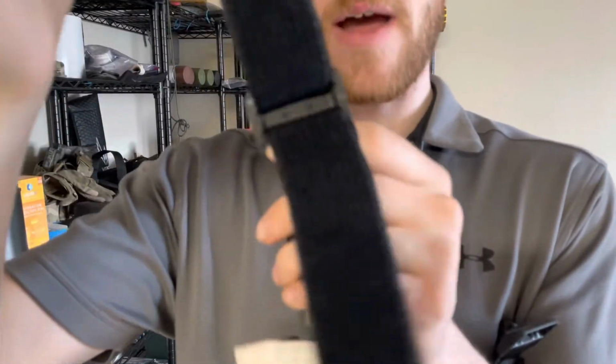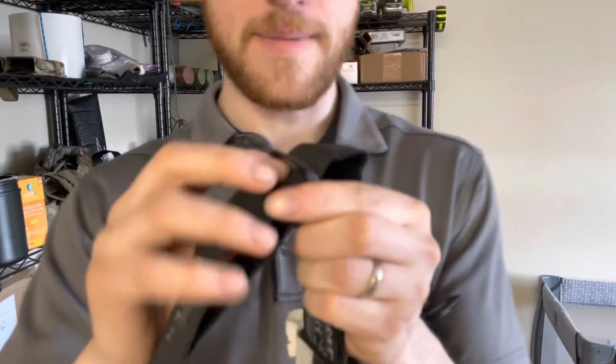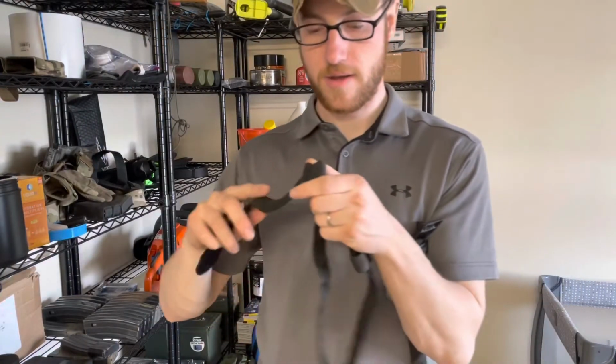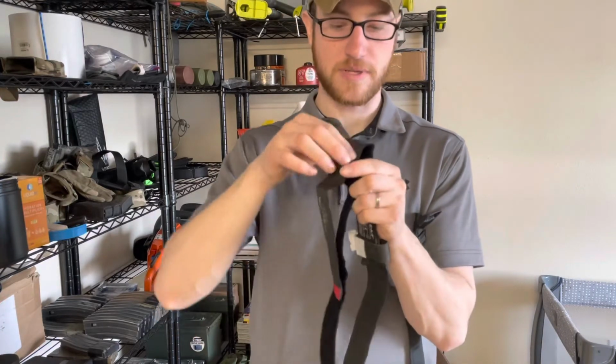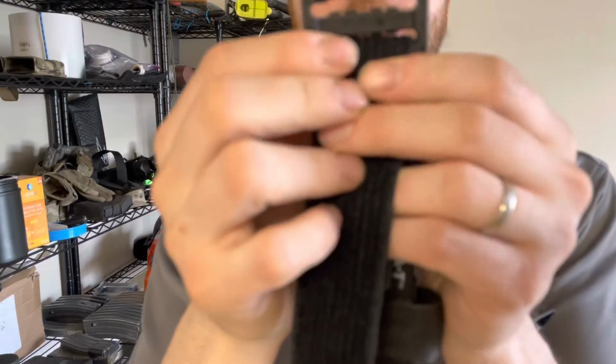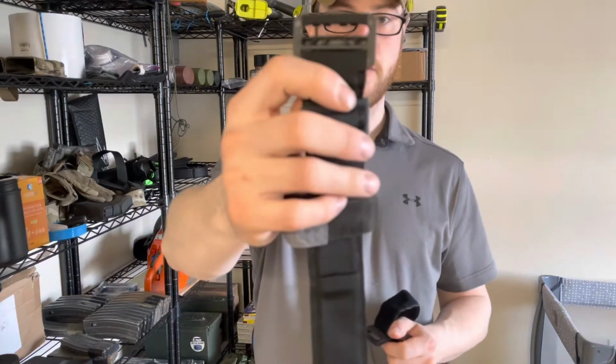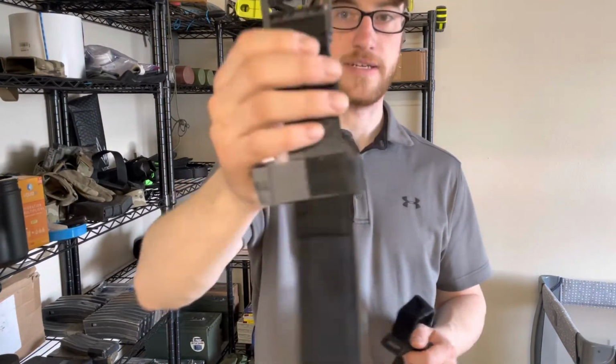I found that was a much more challenging way to use the tourniquet. It made it much harder to get the initial tightening as tight as you possibly could. So I ended up just running through the deeper of the two tabs. This was back in like 2012, 2013 timeframe. And apparently the committee for TCCC agreed because the newer generation tourniquets have the single friction adapter.